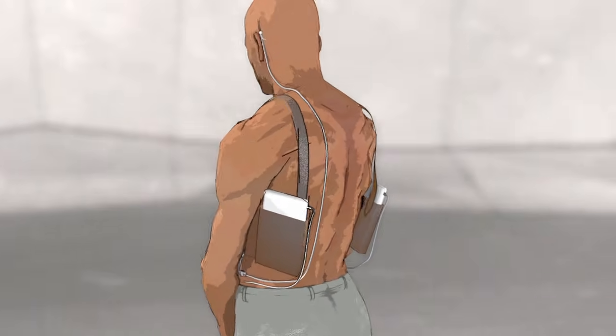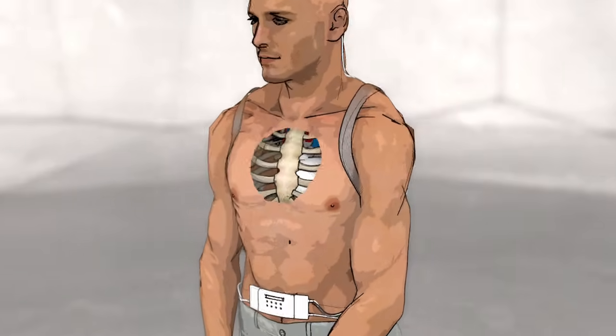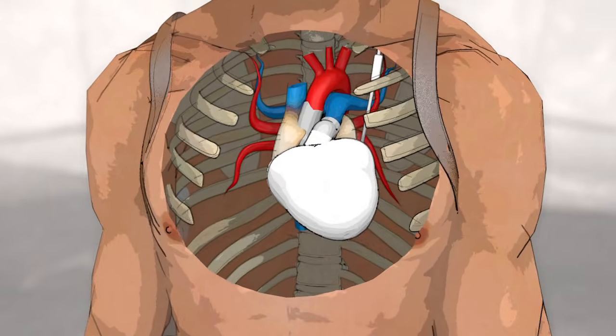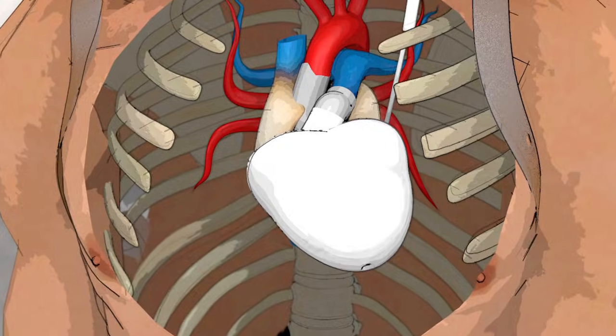The battery has a five to six hour autonomy and is linked up to an external charger via a cable through the skin. Current models are due to last for five years, the equivalent of about 230 million heartbeats.